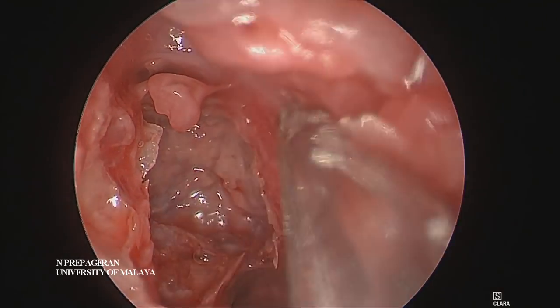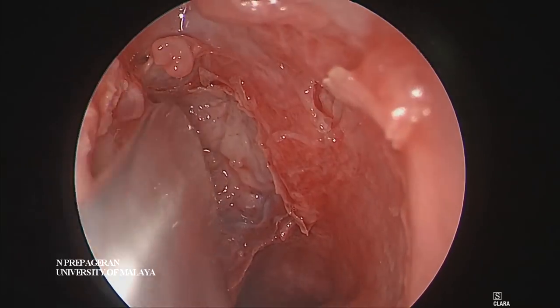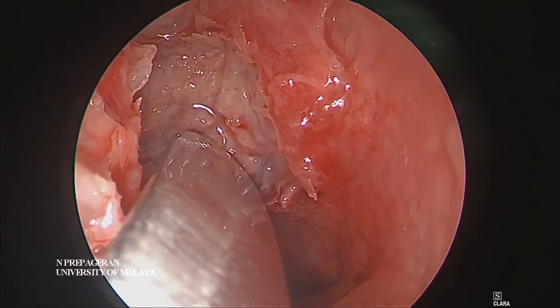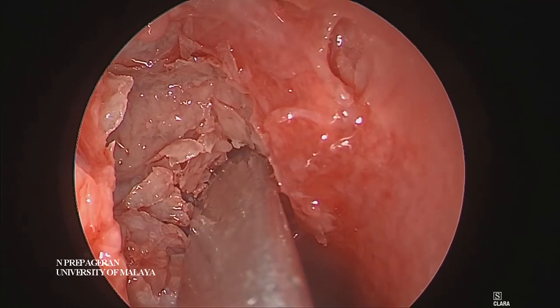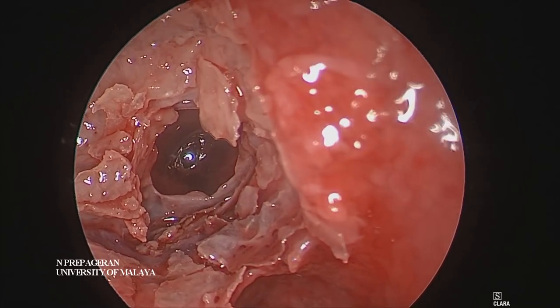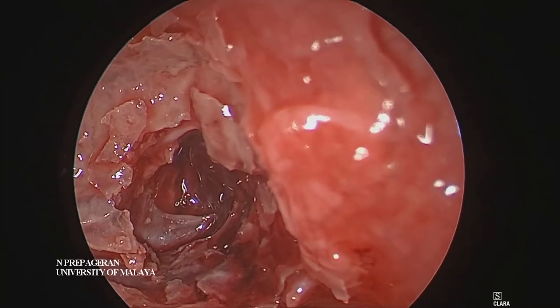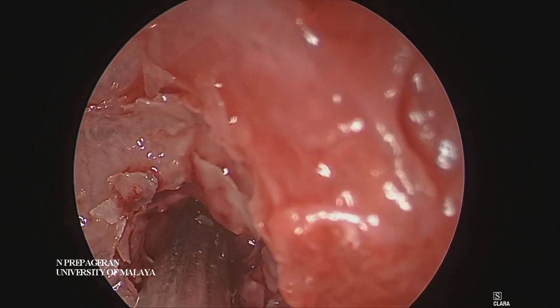The mucosa has been preserved. So what you're looking at now is where the middle turbinate turns laterally to form the ground lamella — that's the vertical part, and that's the horizontal part of the ground lamella. So when you break this, you enter gate number three. And where you enter is always at the junction between the vertical and the horizontal. The anterior ethmoids will have multiple air cells — 11 to 15 small air cells. The posterior ethmoids will usually have very few air cells, but they are much bigger. The idea is you want to preserve as much mucosa as possible.